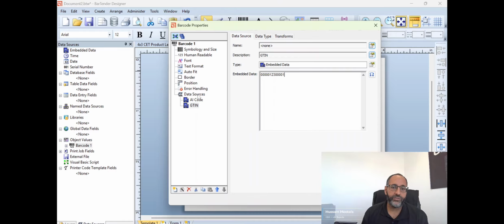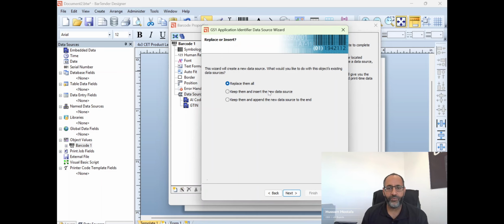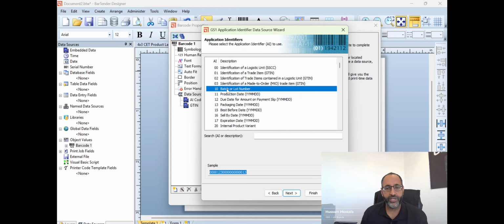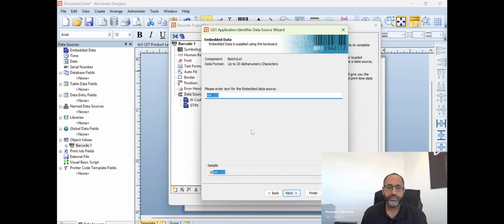And then if we want to add some additional data sources, we can go ahead and click on this wizard. It's called the GS1 data source wizard. We'll click on that in the application identifier. Now we can add additional production identifiers to it. So we'll just go ahead and click Next here. We'll say keep what we have currently and insert the new data source. And for example, if we want to add a lot or batch number, we'll choose the application identifier of number 10. And we'll click Next. And we'll click Next here. And then we could enter that lot number by choosing the embedded data type. And then we'll click Next. And for example, we could just say lot number is 12345. We'll go ahead and click Next.